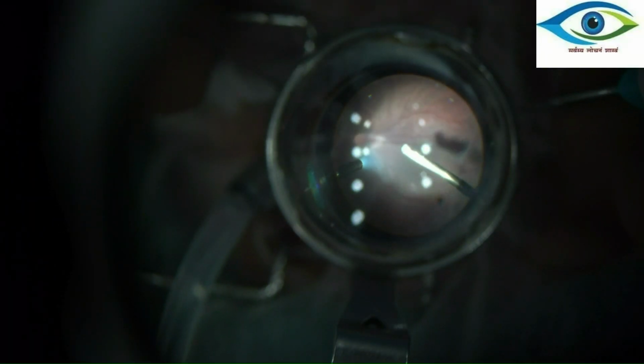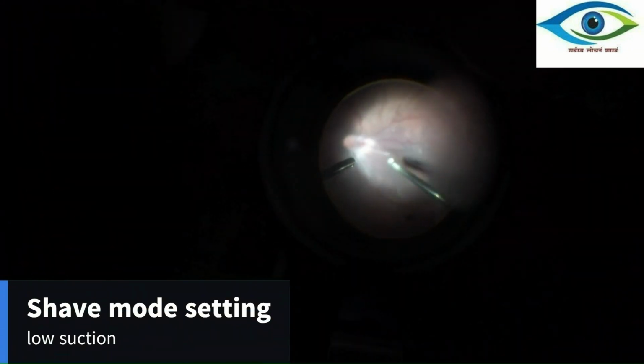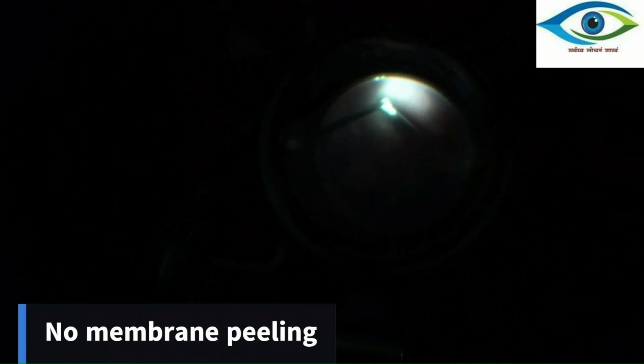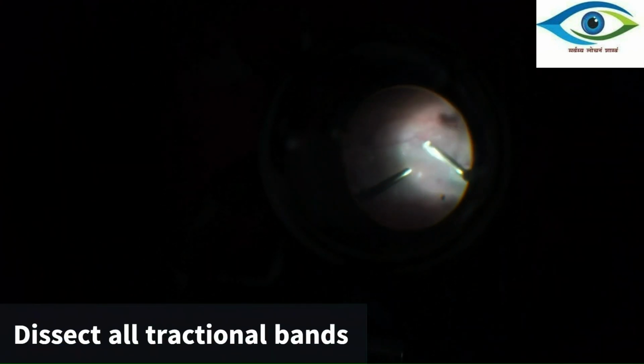The entire vitrectomy is performed using shave mode setting with low suction. One should not attempt to induce PVD. There is no need to peel the membrane, as it's difficult to differentiate between vascularized membrane and retina, and hence can result in a retinal tear. Vitrectomy should be limited to enough to release all the tractions.